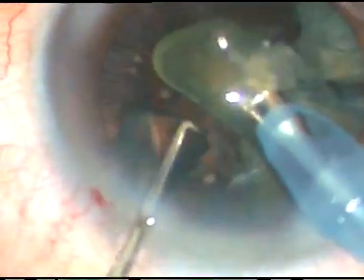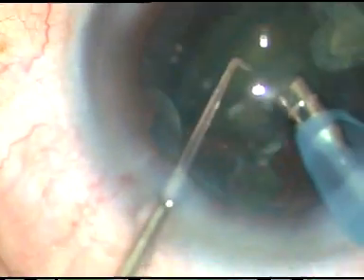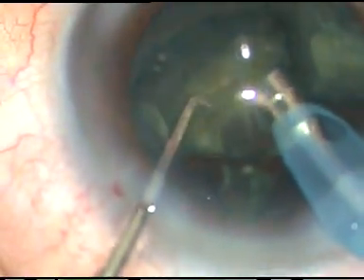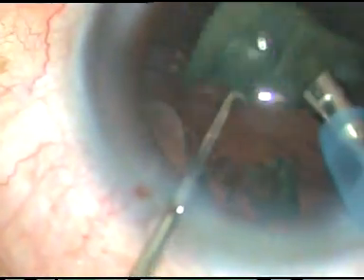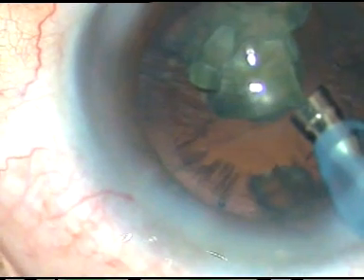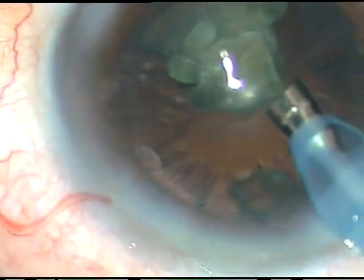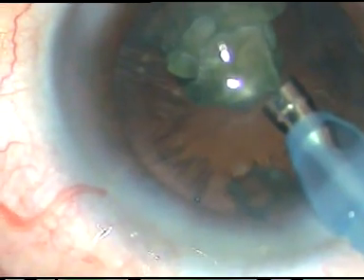And now, during the emulsification of the last nuclear fragment, the instrument that will be used is PCP — that is Posterior Capsule Protector. It has a curvature which conforms to the curvature of the posterior capsule. Here it is.